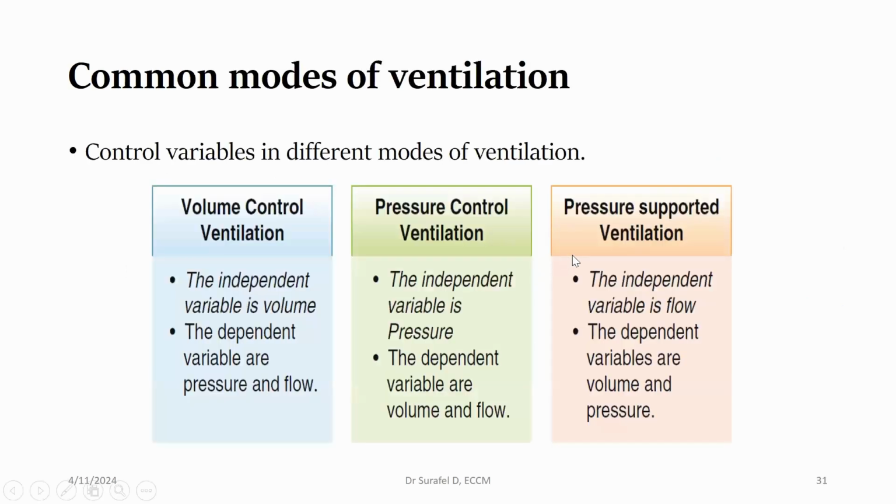Okay. So when you come to the modes of ventilation, the commonest modes are volume control ventilation, pressure control, and pressure supported ventilation. These are the commonest ventilation modes that we use in our day-to-day activities.